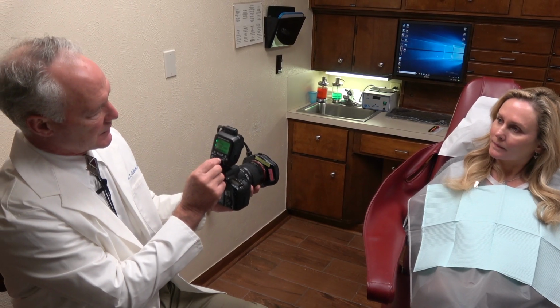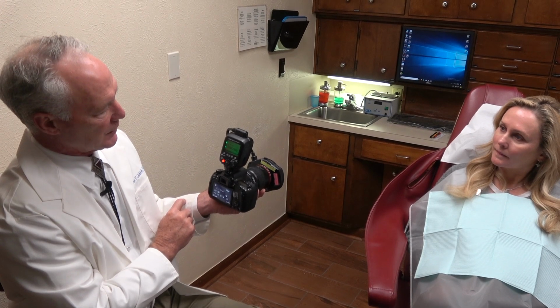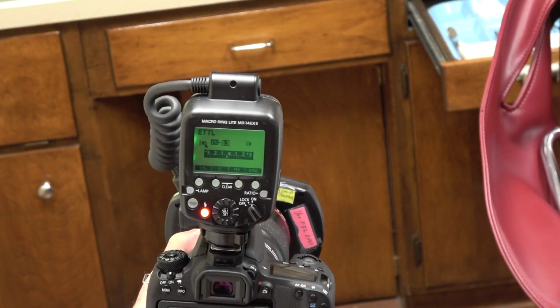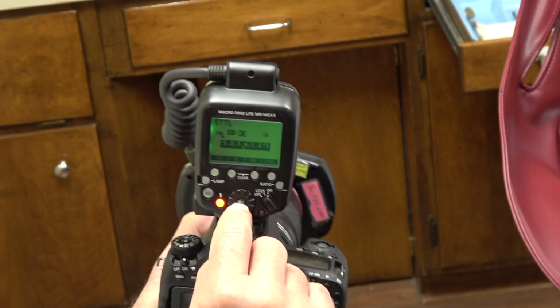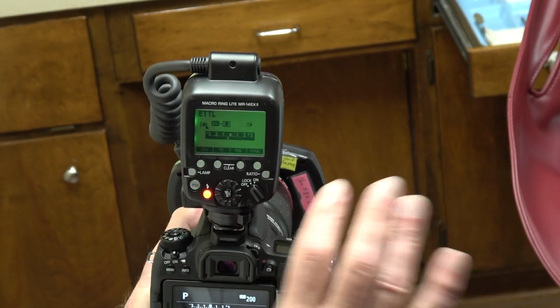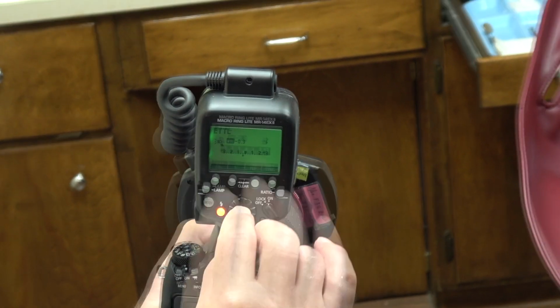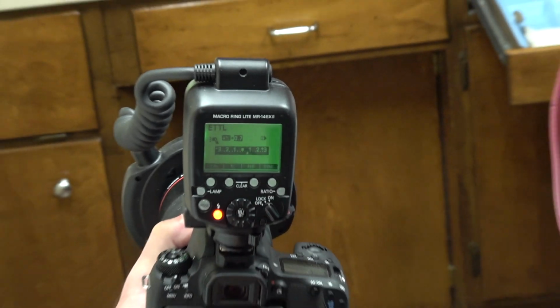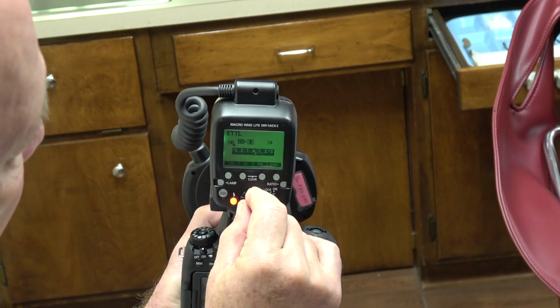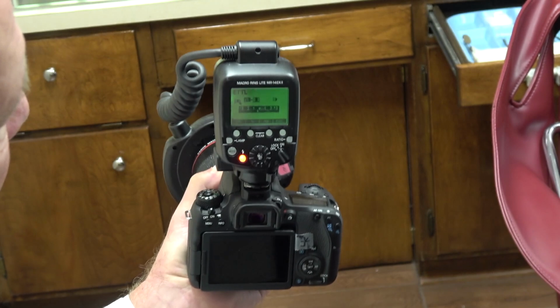I wanted it just a tiny bit darker, so it's one click to the left, and you don't have to reset it, just leave it like that. If the photos are too dark, then you push the setting and move it to the right of the neutral button. So I want it one click to the left.